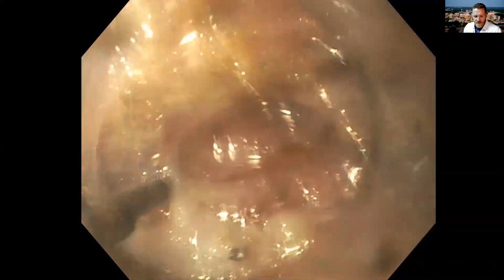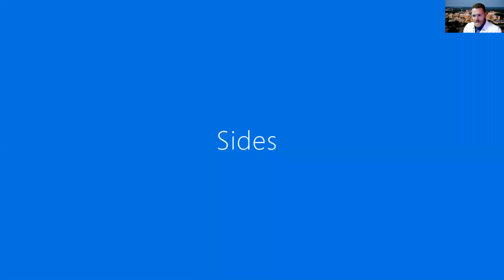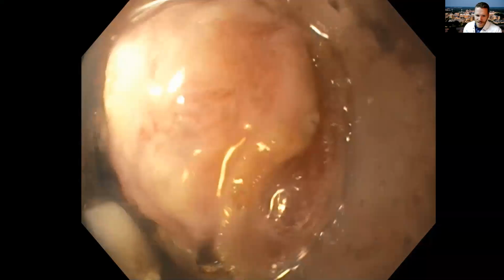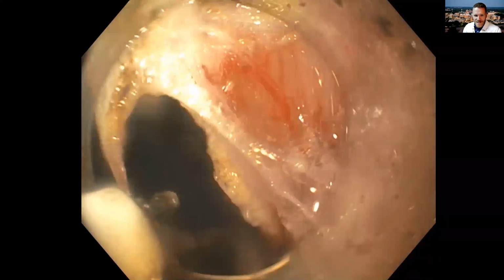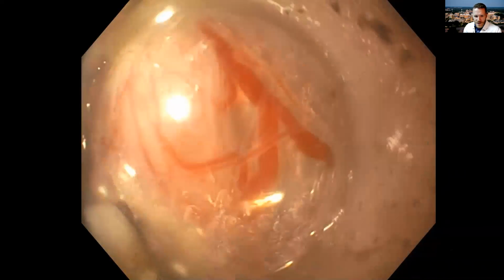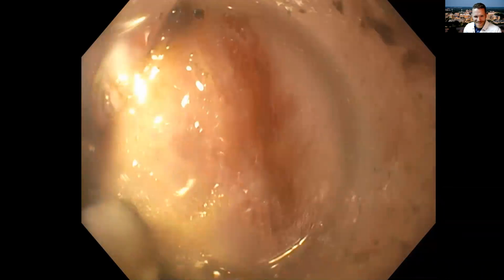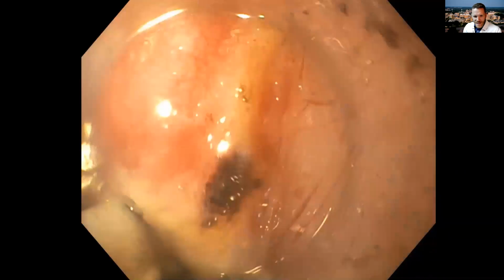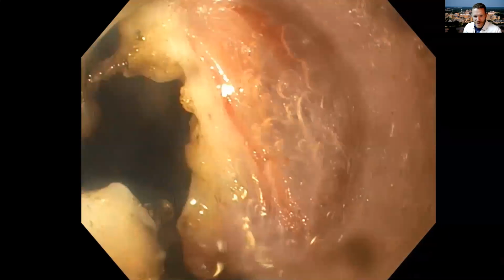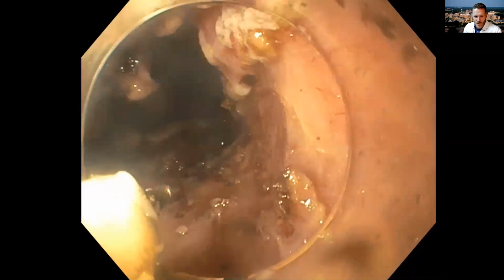You see the muscle beneath us and the tumor above us. And then we just have to take the sides down, which I say is often one of the harder parts. This is the tail end of the right side. I thought I'd give the audience the satisfaction that took me hours to earn here. This is the last little bit, which is very gratifying. You get the tumor free, and you know that you're almost home free.